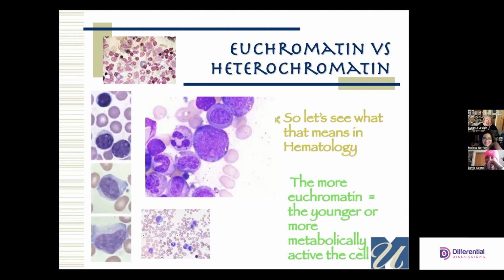It's going to have some significant parts that are heterochromatin. But look, the sides of the nuclear membrane aren't quite as thick or patched as this is. These are almost free-floating aggregates. They haven't quite gotten to the edge of the nuclear membrane yet.